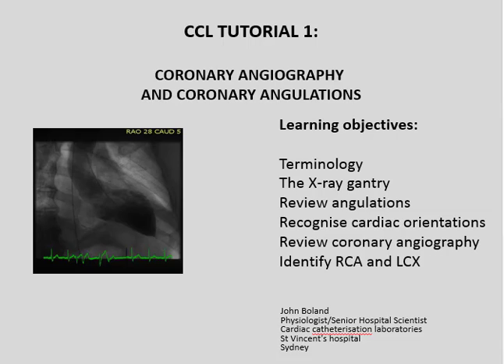However, lectures 1 to 4 cover mainly anatomy, cardiac anatomy, general anatomy that I'm sure you're well trained on, that were intended more as a revision, and an introduction to the cardiac work you're going to be doing, particularly in your roles as echo techs. But as echo techs, you will at times work in the cath lab very closely with the cardiologist in relation to these X-ray images. Have a look at this first image on the left. It's a standard ventriculogram that you've seen before, backbone on the left-hand side, and we see the heart in profile. We'll have a look at the next slide.